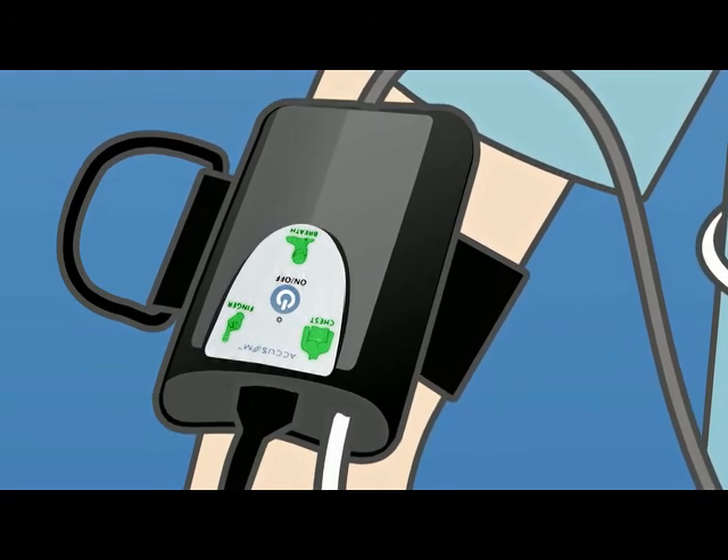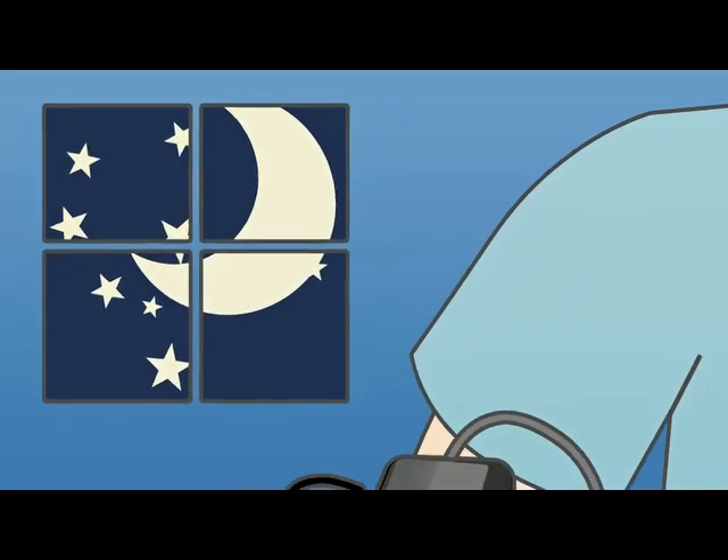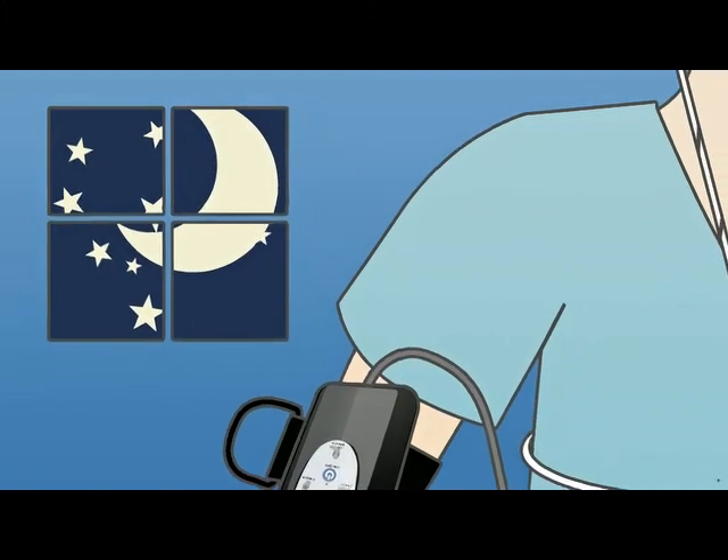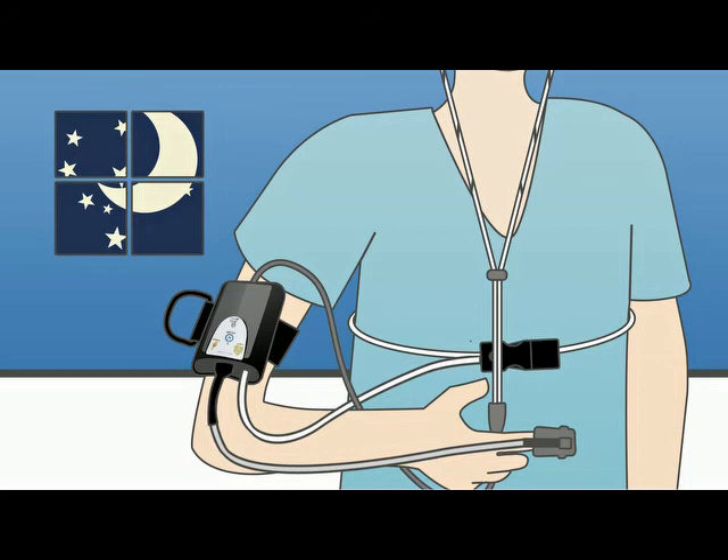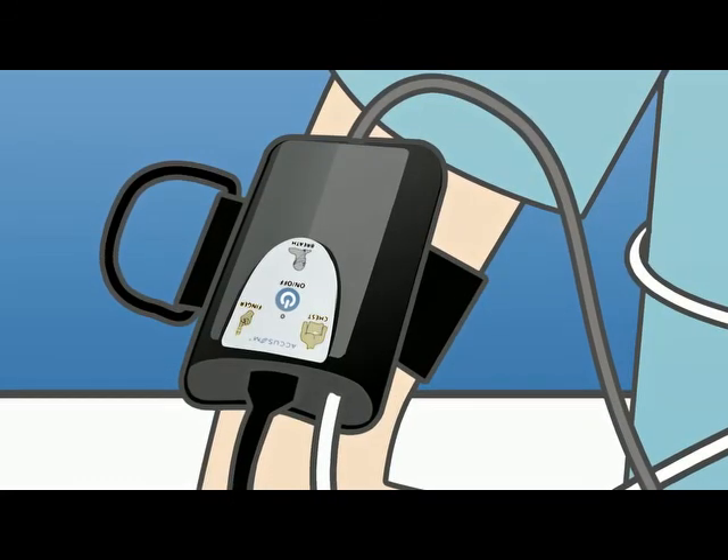If you need to get up at night, just leave the sensors in place. If there's a problem with a sensor at any point during the night, the Accusom will announce 'check sensor' and the sensors needing attention will flash a yellow light on the device.